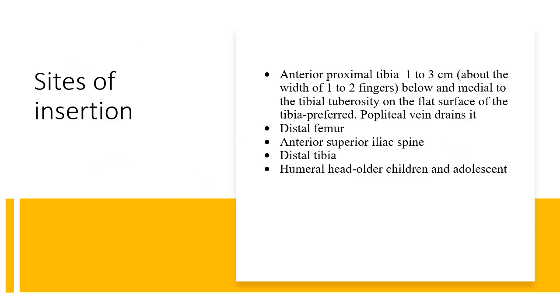So where are you going to insert these needles, be it a Jamshidi, Cook's needle or an automated drill? The most common site in pediatrics is anterior proximal tibia, 1 to 3 centimeter below and medial. Please note that it is medial and not lateral. Okay, it's medial to the tibial tuberosity on the flat surface of tibia.